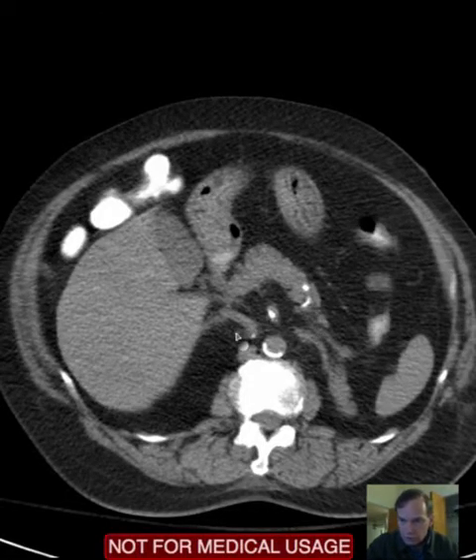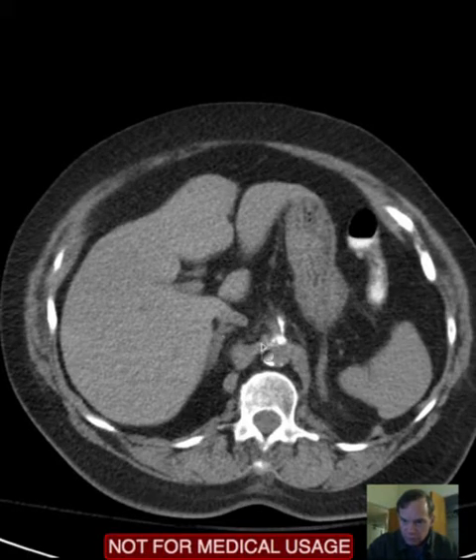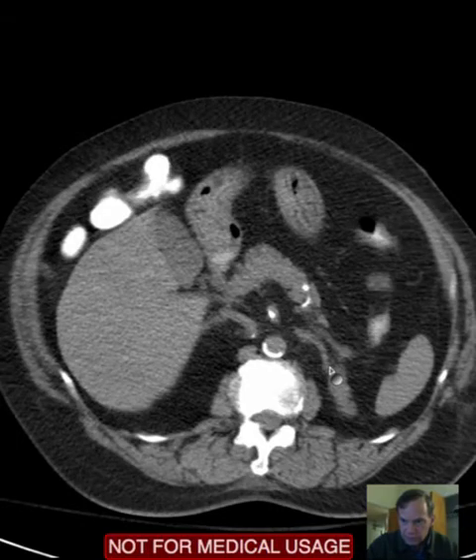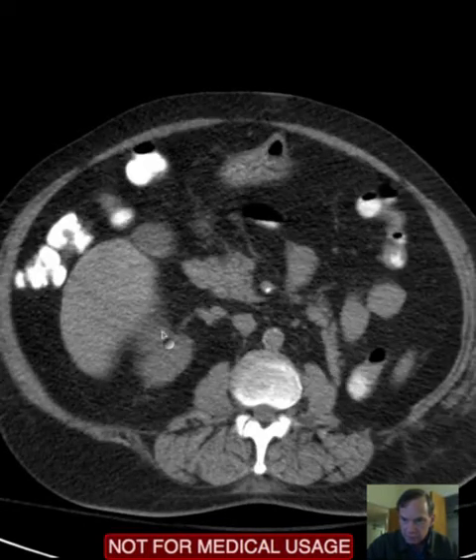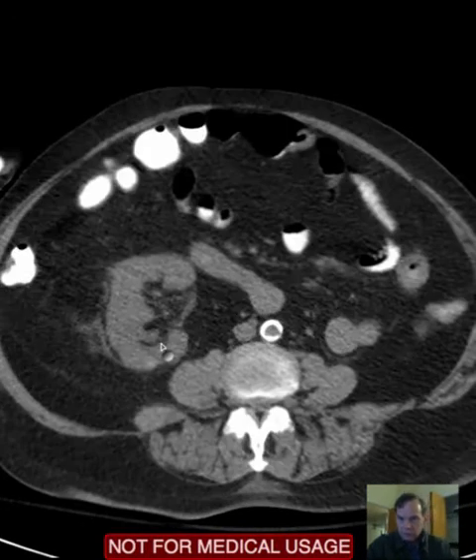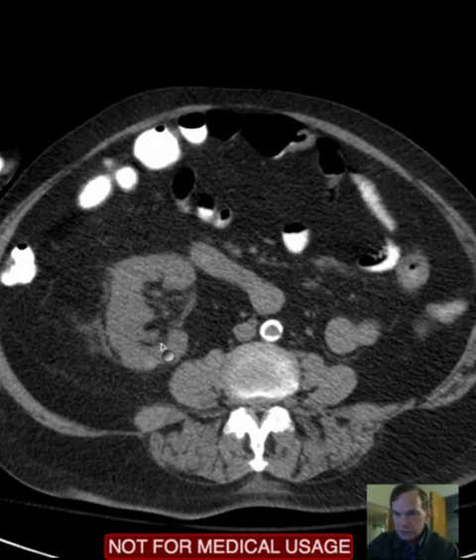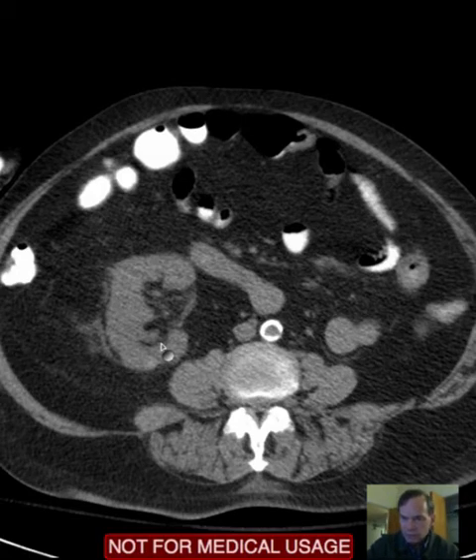We do see an adrenal gland on the right. We also see one on the left; however, we do not see a kidney on the left, whereas we do see a kidney on the right. Again, that's because this is a developmental anomaly — a pelvic kidney — that just happens to be present in this case.